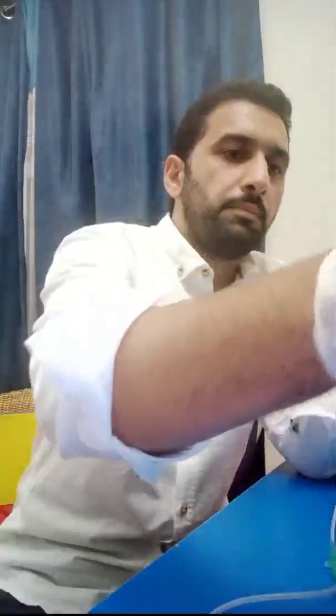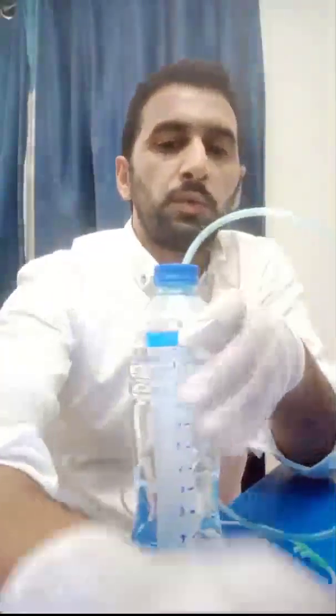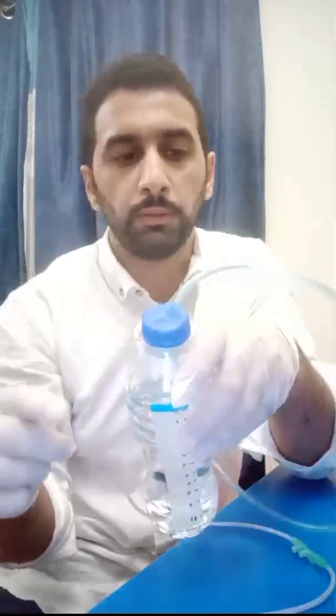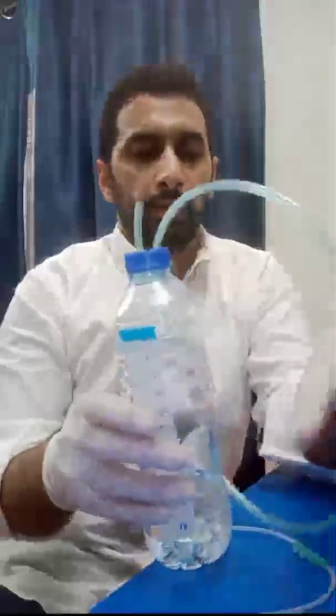Connect that tube into the bottle and insert it to the desired level — we usually start at five centimeters of water. For the remaining opening, I have made a small cut from the other nasal prong to create a chimney-type outlet to allow air to escape from the bottle. So this is the complete circuit: the nasal part goes to the patient, and the two ends of the Y-shape connect to the flow meters — one for air and one for oxygen.